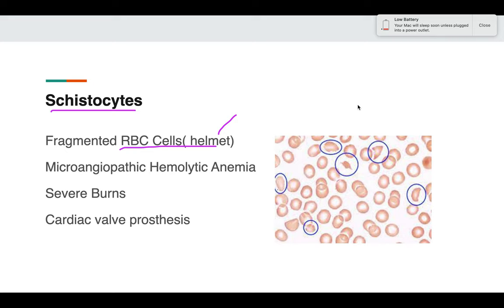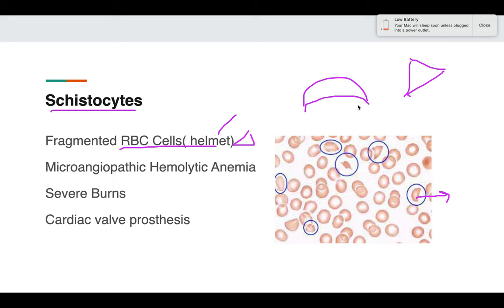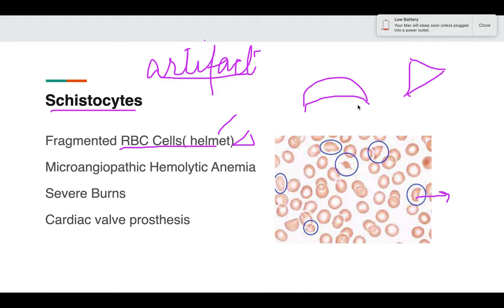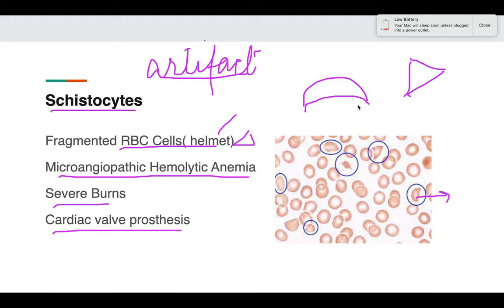Schistocytes are fragmented RBCs that appear as a helmet or triangle shape. Fragmented RBCs can be artifactual if the sample is not correctly preserved. However, if they are increased in number, they can be seen in microangiopathic hemolytic anemia, severe burns, and cardiac valve prosthesis. Therefore, always take the history of the patient, and to reconfirm, a repeat sample can also be taken.